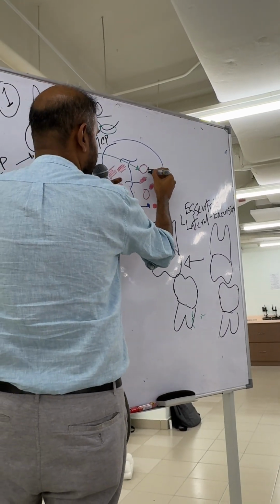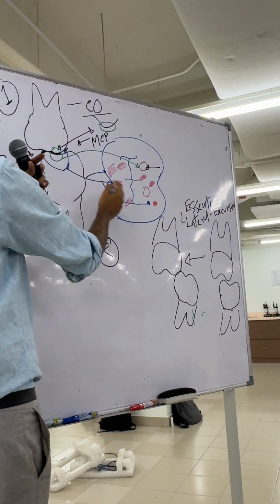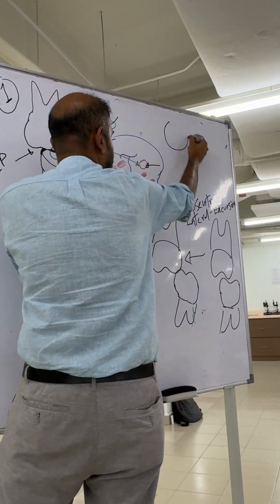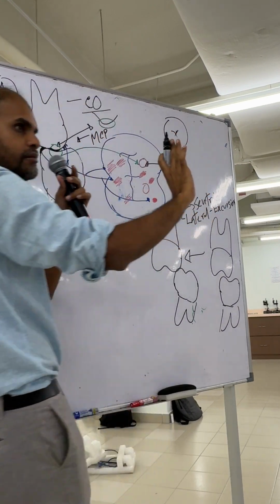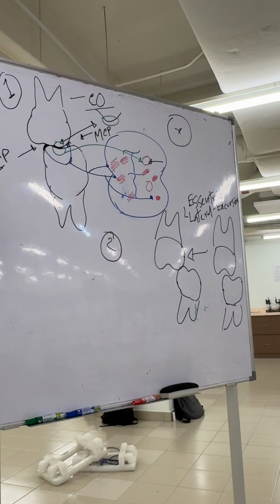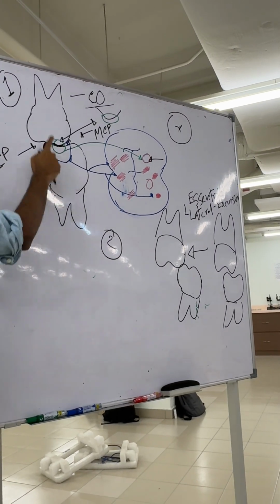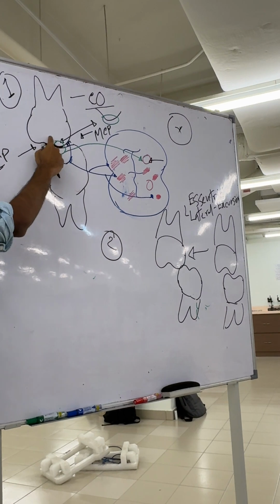This one is exactly coming from this one. The one with the circle, center part is empty, is exactly coming from the two cusps. One cusp is the upper one, the other cusp is the lower one. Upper one, which one?